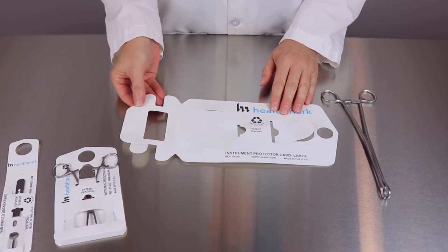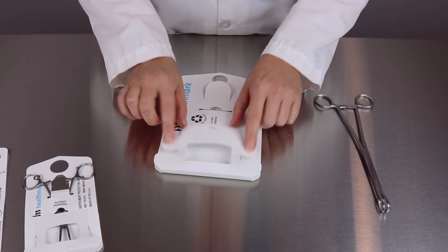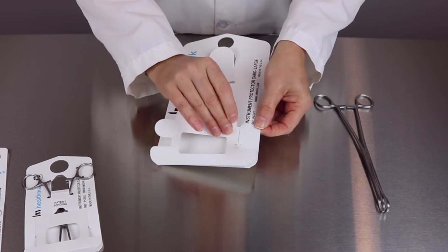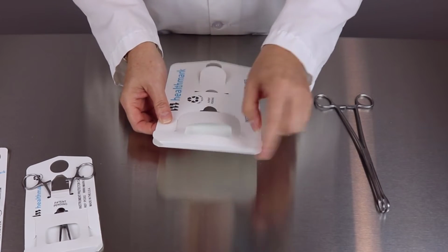So what you're going to do is take this flap and fold it over 180 degrees. Then you're going to take the locking tabs on either side and put them through the receiving slots. And then this will create a flat edge at the bottom.